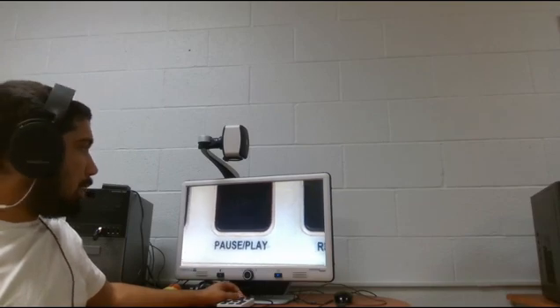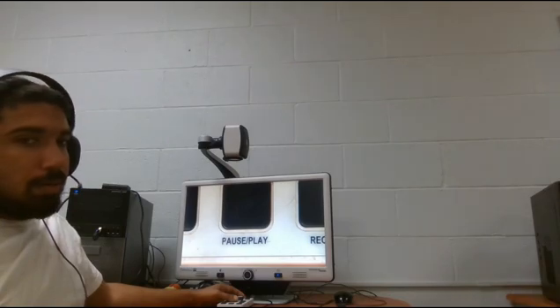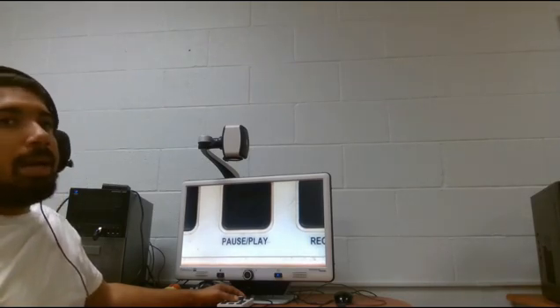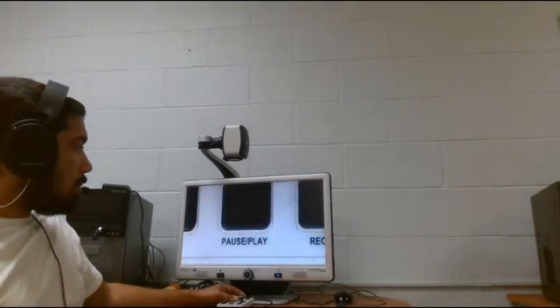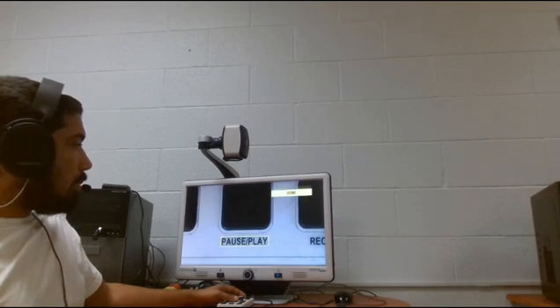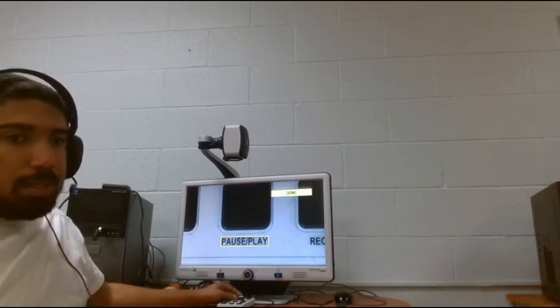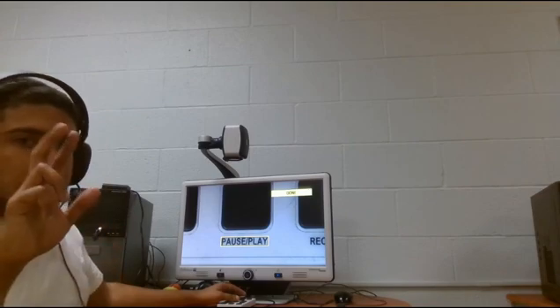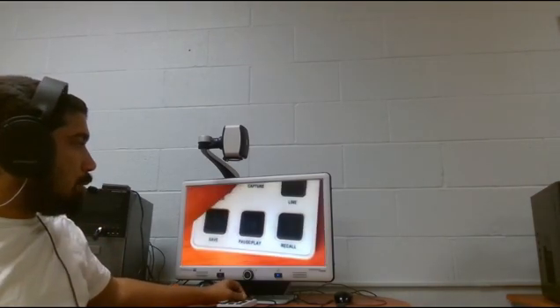As you can see with this demonstration, not everything works correctly the first time, which I will talk about a little bit in my pro-con section of the video. As you heard, it said pause play, which means that it worked. And to get back to the desktop, so to speak, you just press the capture button again.